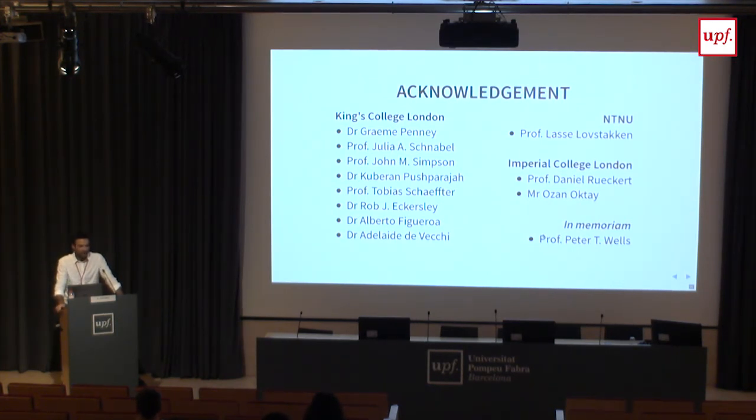And so then the third thing is if you want to compare 4D flow in MRI and ultrasound on real patients, then you have to acquire the data in the same conditions. And this is very difficult. So for starters, in MRI, people are lying on their back. In ultrasound, you will be laying on your side. Then in MRI, if it's, for example, small children, they will be under general anesthesia. So if you want to have the patients as well under general anesthesia in ultrasound, well, it's tricky, but you normally won't get that. Then under anesthesia, it's limited how representative of the actual flow it is.